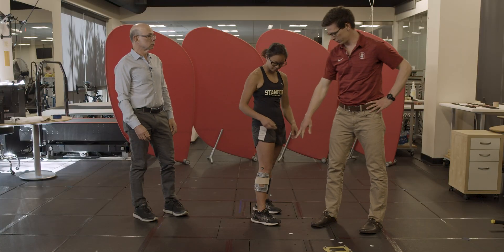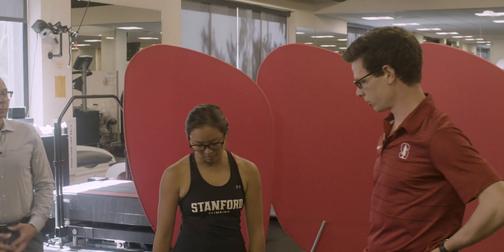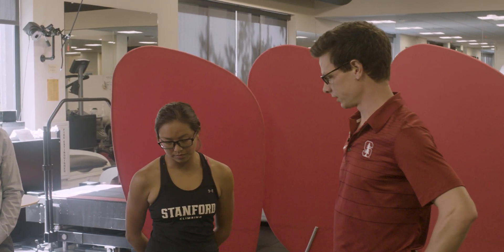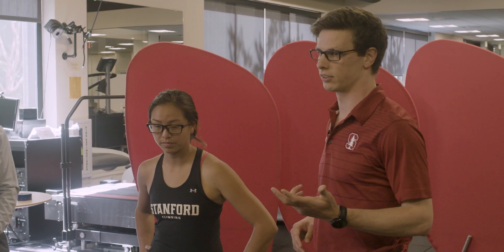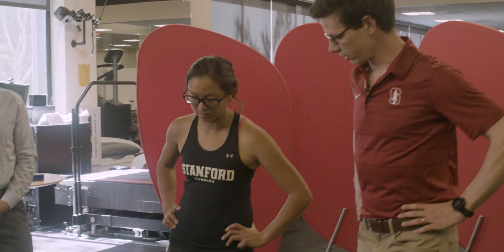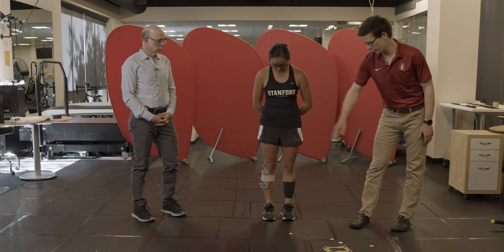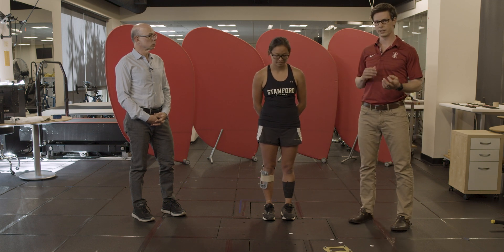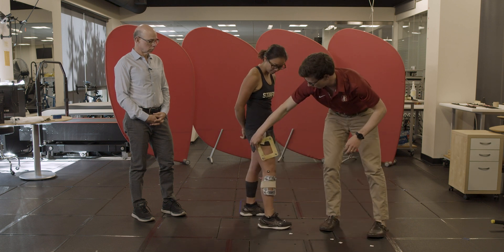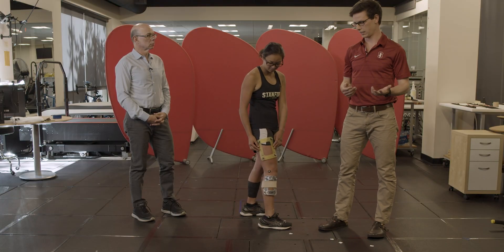When we get up to the hip, we've established the ankle and knee joints as pin joints. But the hip is a three degree-of-freedom rotation joint, and we can't put markers on the center of the hip joint. So we perform a functional trial to create a functional reference frame and understand the functional hip joint center — Hannah would move her hip through a large range of motion. With markers on her pelvis and femur, we find the point moving the least in both the femur and pelvis, and we call that the hip joint center. We establish the position of the hip joint center relative to the tracking frame on her thigh, so for all dynamic trials we can know where her hip joint center is without ever putting a marker on it.